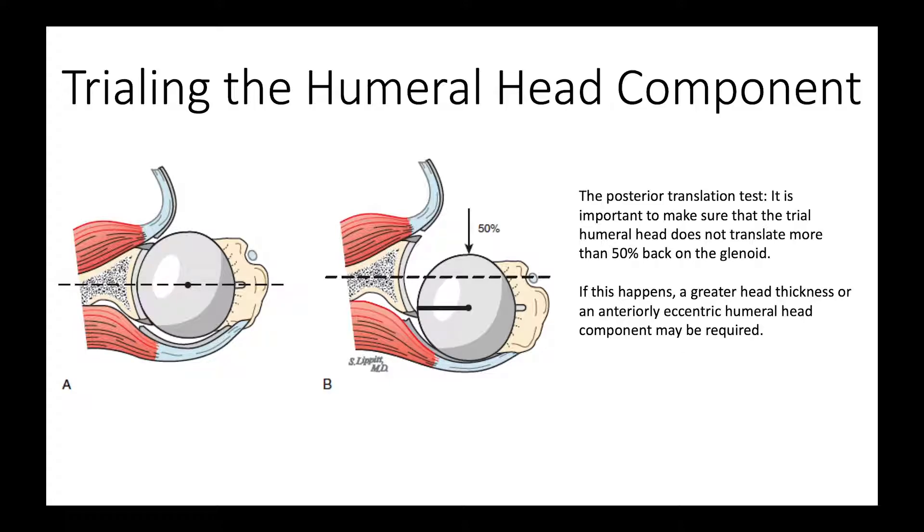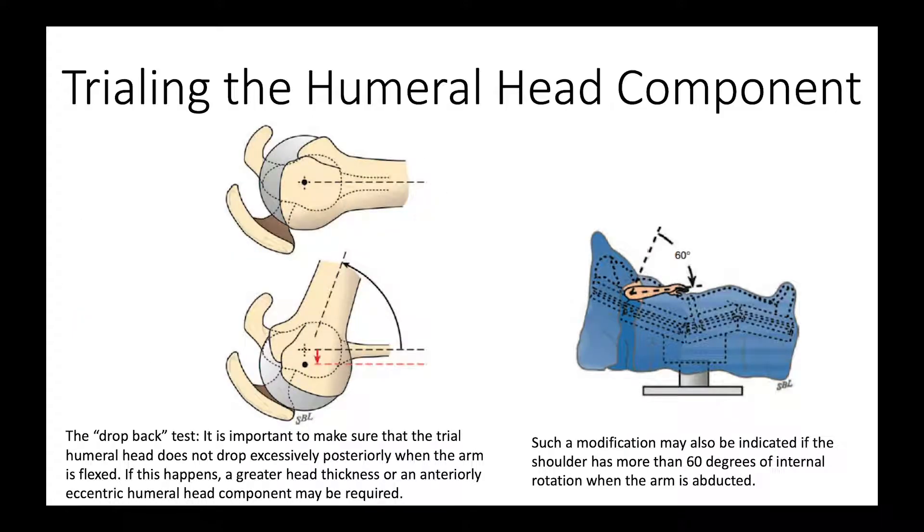We trial the humeral component, and what we want is 50% posterior translation, as shown here. That gives us enough laxity for activities, but also enough stability so that the shoulder doesn't drop out of the back.